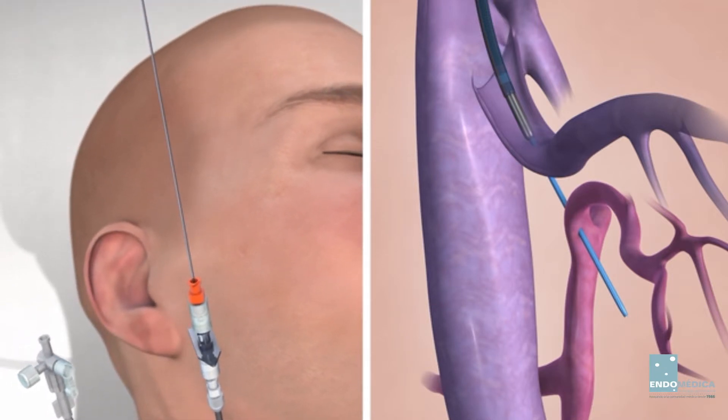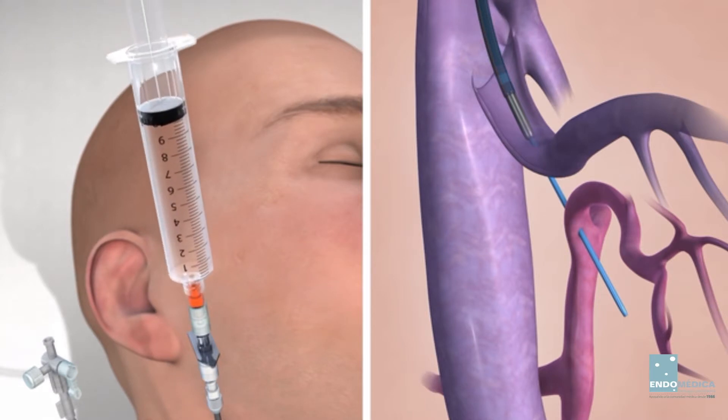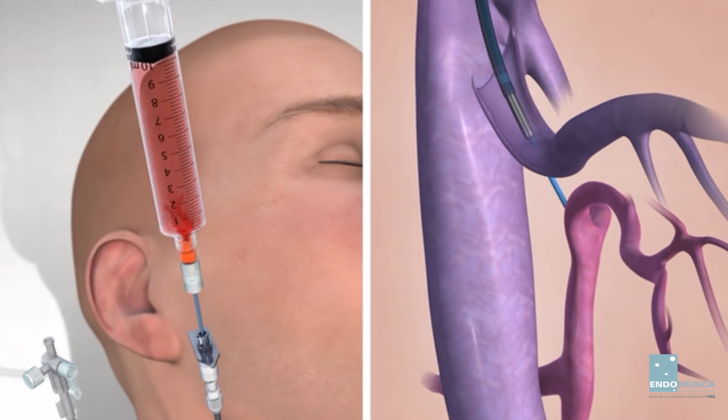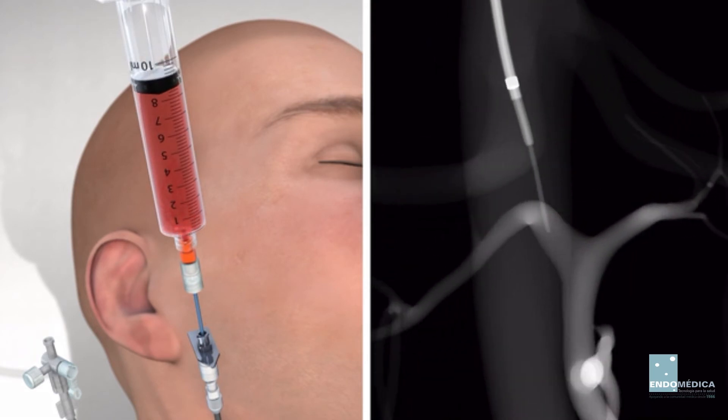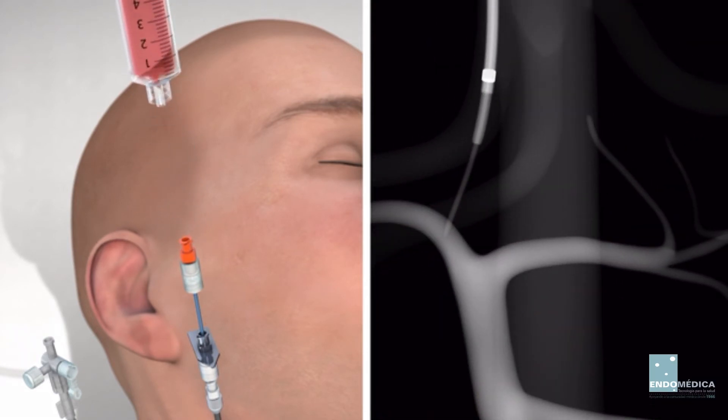Remove the stylet from the 5 French catheter and connect a syringe with contrast medium to the catheter. Apply suction and withdraw the catheter until blood is seen. The tip of the catheter should be positioned within the portal vein as indicated by blood return. Inject a small amount of contrast medium to confirm the catheter's position in the portal system.